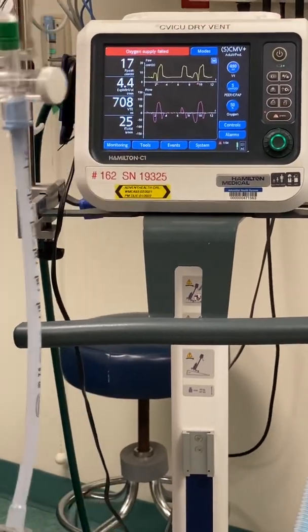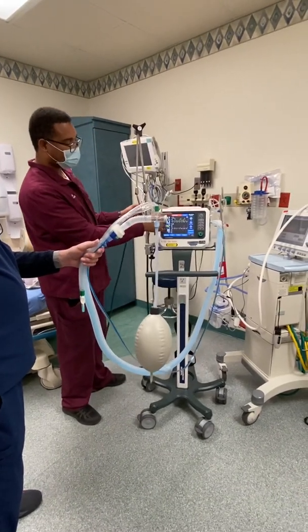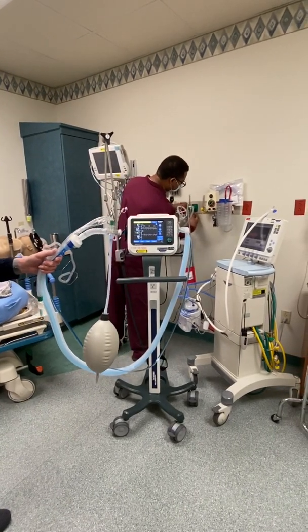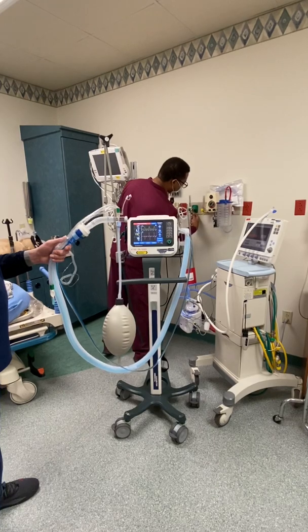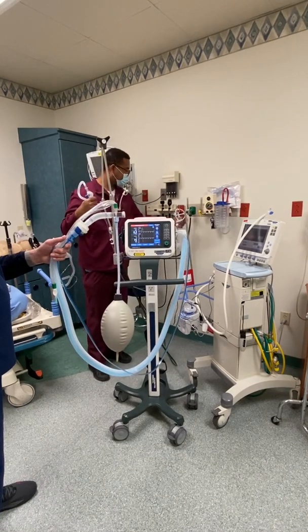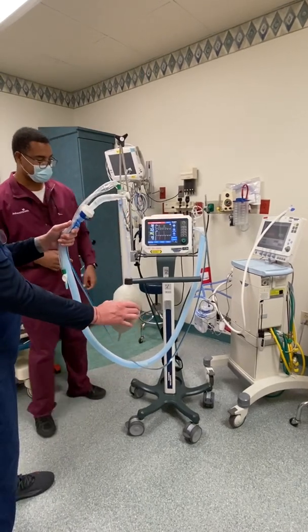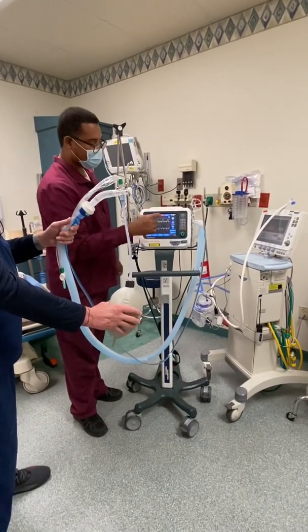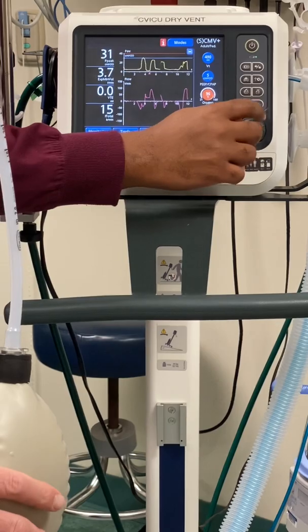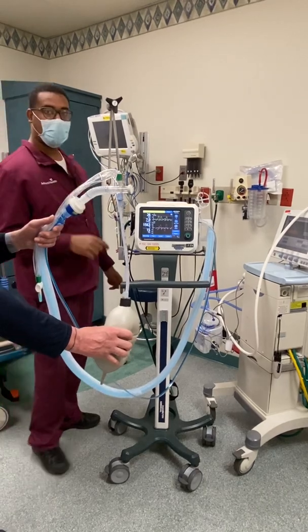As you can see, there's an alarm for O2 supply failed — you want to make sure the O2 is connected. In the event the doctor wants to bump the patient's oxygen up, you tap, turn, and tap again.